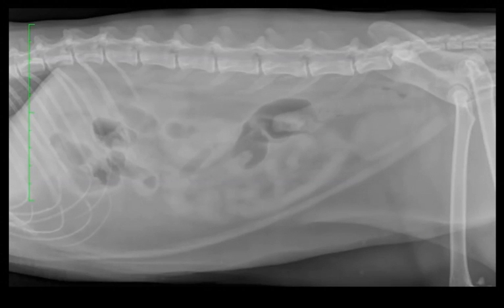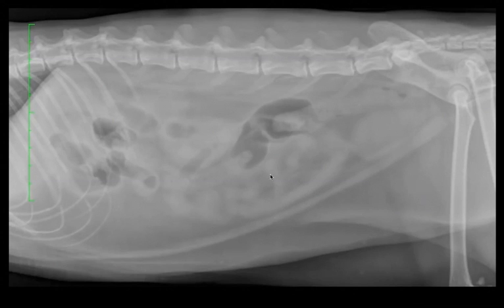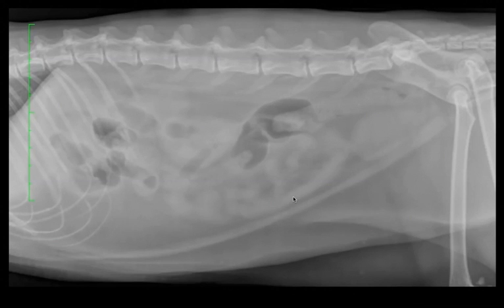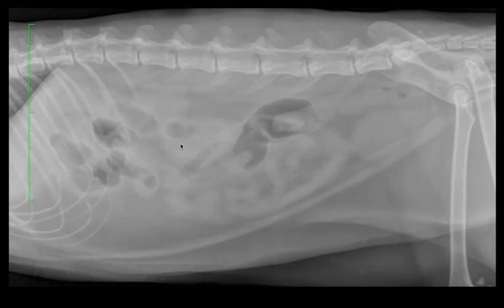On this lateral view, we notice two populations of bowel. We see ventrally several jejunal loops, collapsed and normal in diameter, contrasting with the other segments located craniodorsally, which are now either fluid or gas distended.